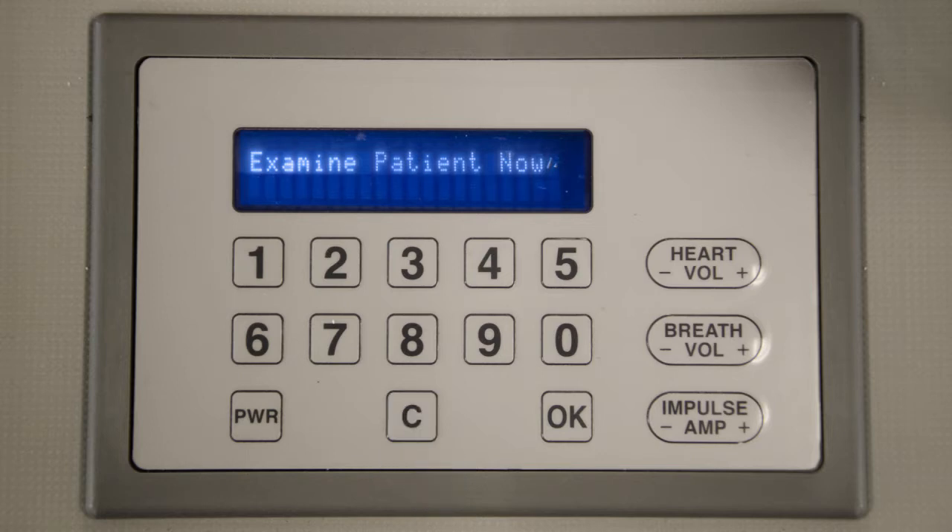Harvey will shut down 30 minutes after the last key press or use of the stethoscope to auscultate. To power off, hold down the PWR button for a few seconds.